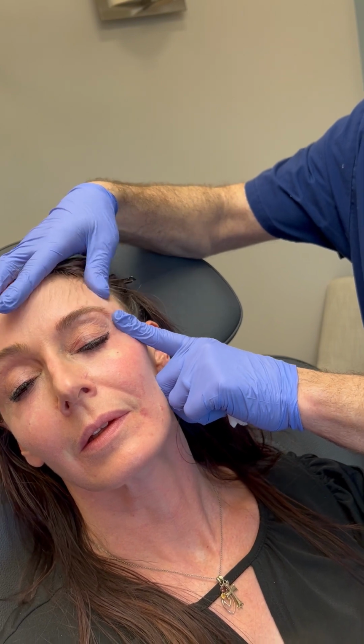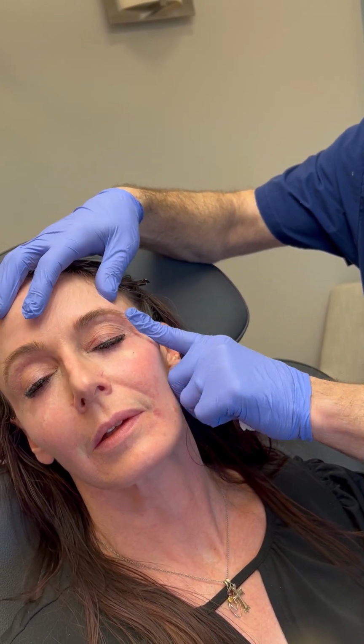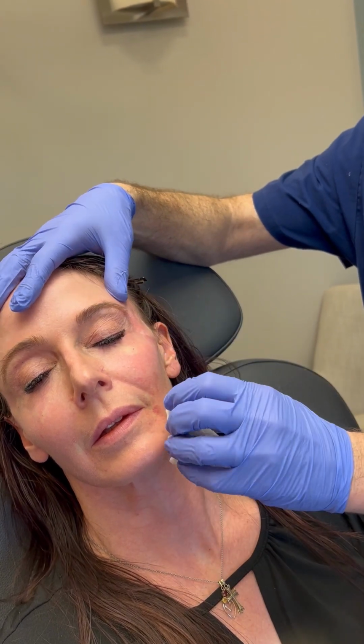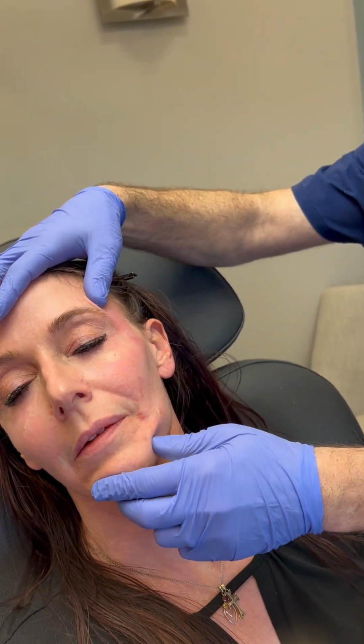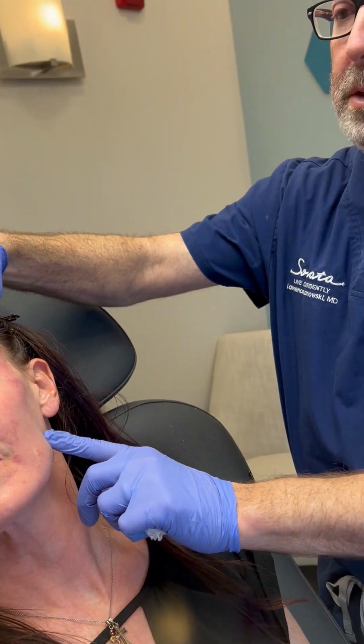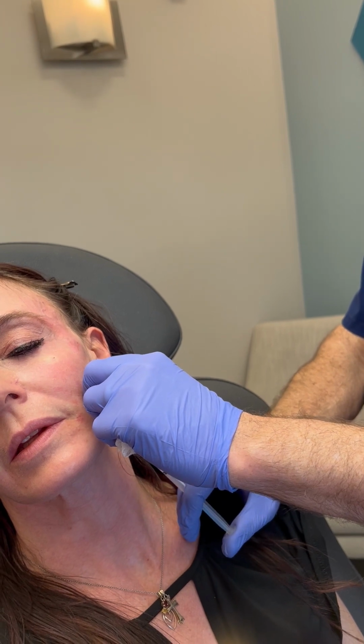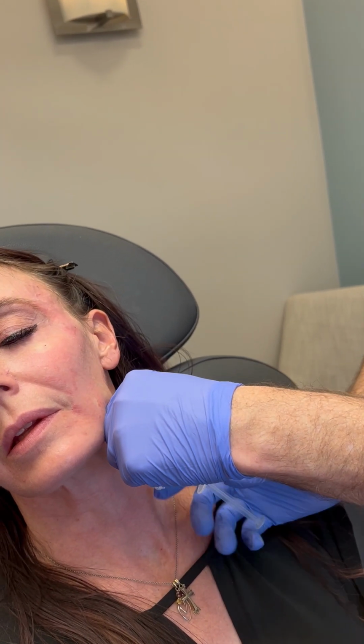Once we have our temples done, we'll just massage it a little bit, and then we'll go into this area, which I call the preauricular area. You can see she's got the cheekbone, but she's quite hollow underneath, and now we switch to needle. We don't need a cannula for these other areas. You can use one if you want. And we're going to push ahead as we do this.